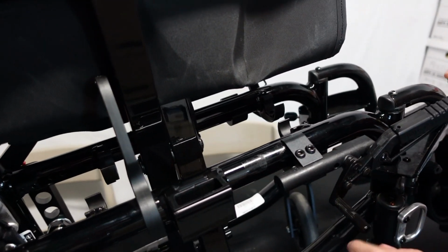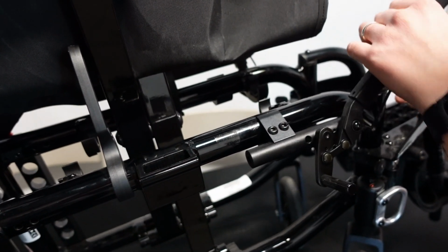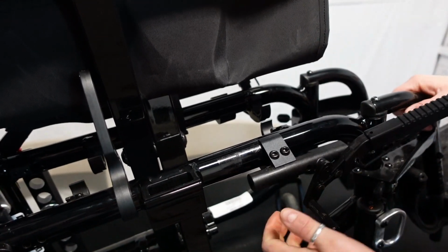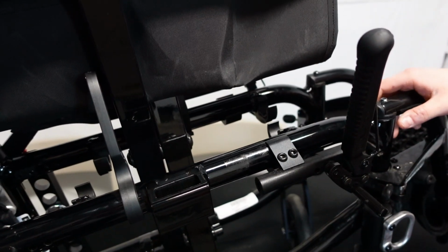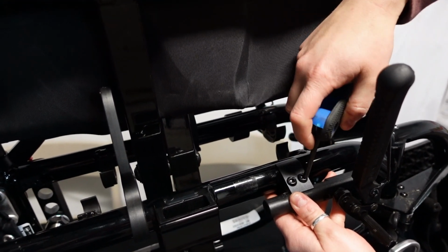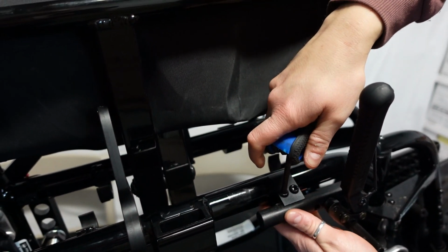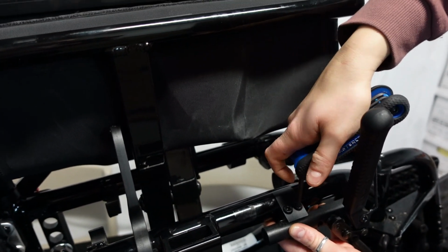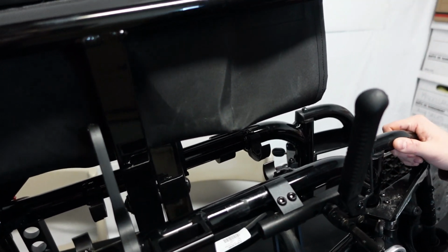What you want is to have this straight. You don't want it pointing down or up. You want it against the tire, straight. Some people get it wrong because it turns on the round tubing. We can adjust it once the wheel is on, just so you can see how straight it is. You just moved it back a quarter or three-eighths of an inch, because we were kind of close to the tire. It just needs a little adjustment. Now that looks good.